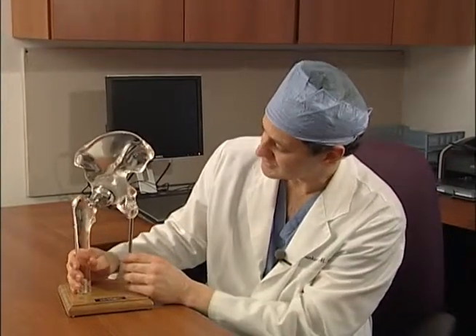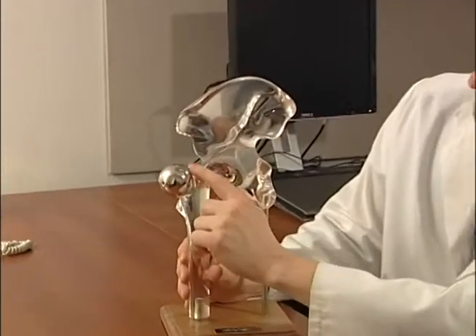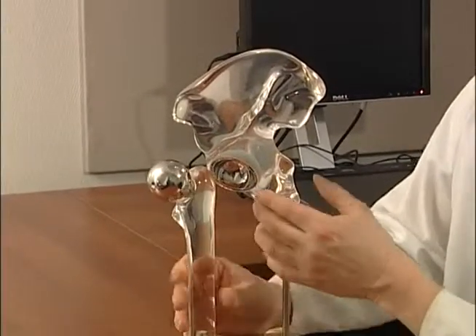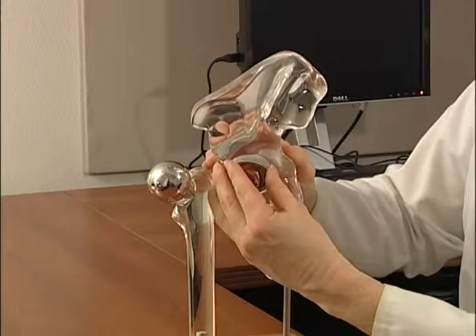You can see it's a metal cap that goes over the femoral head here, and it fits into a metal socket that we implant into the pelvis.